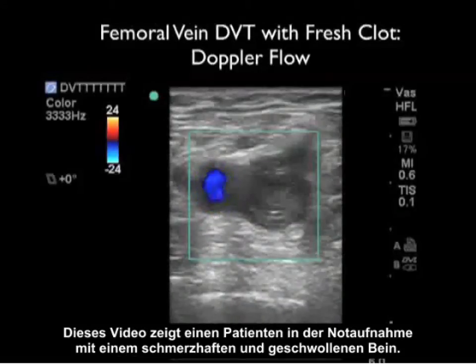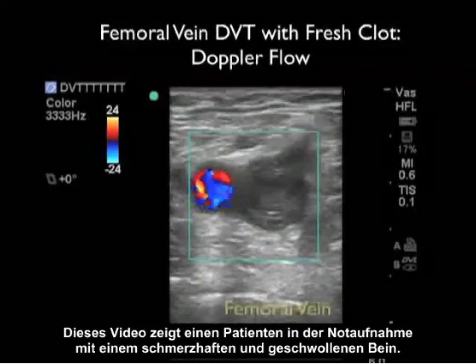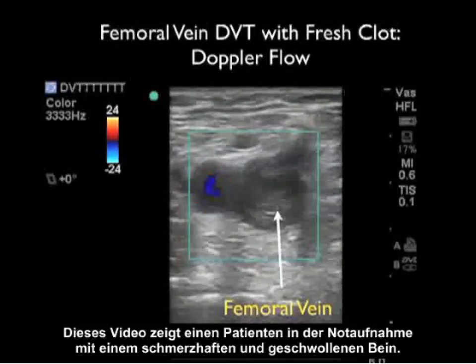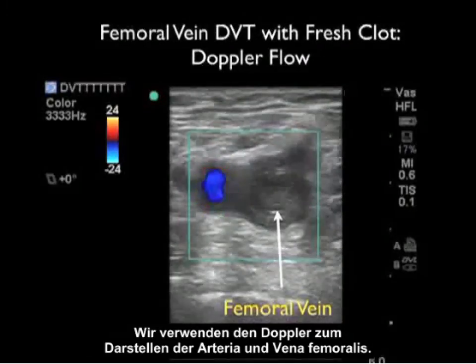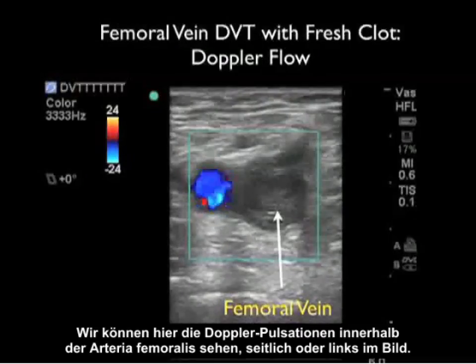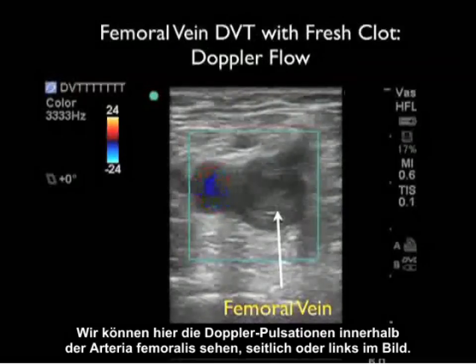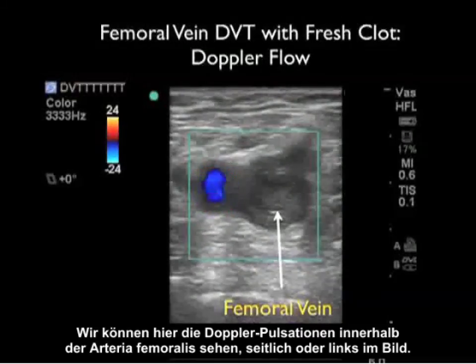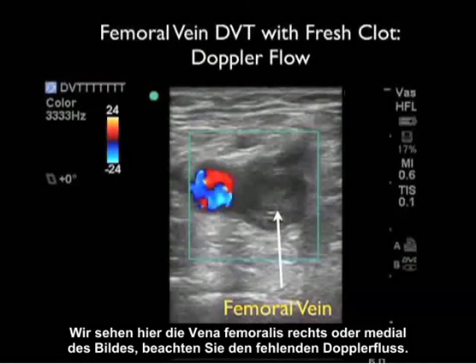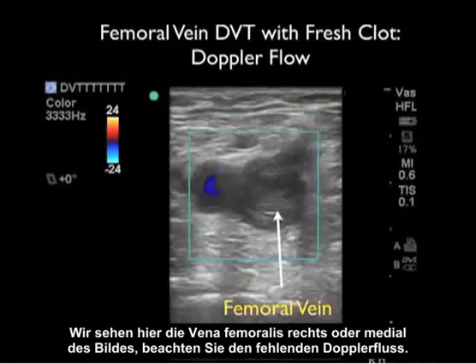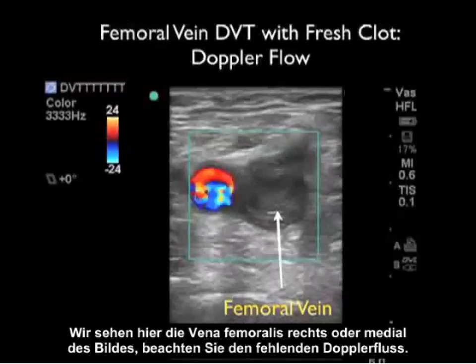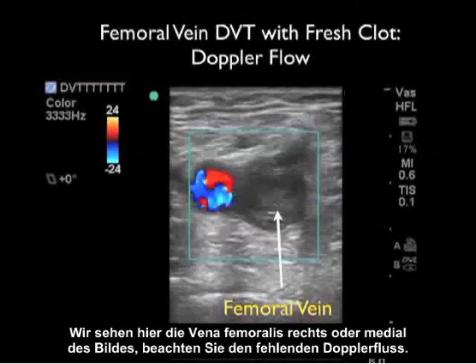This video clip is taken from a patient who presented to the emergency department with a painful and swollen leg. We're using Doppler flow to first identify the target femoral artery and vein. We can see the Doppler pulsations within the femoral artery, noted lateral or towards the left of the image. We see the femoral vein towards the right or towards the medial aspect of the image, and note the lack of Doppler flow.